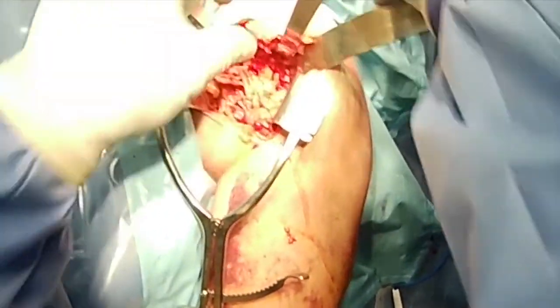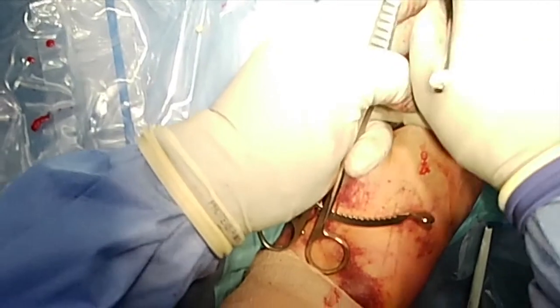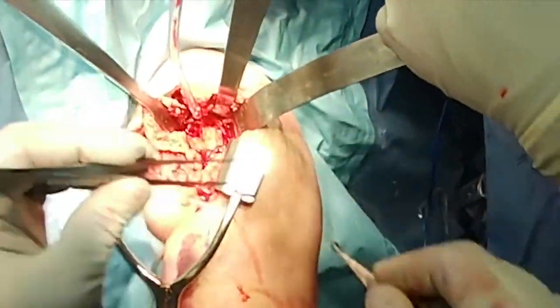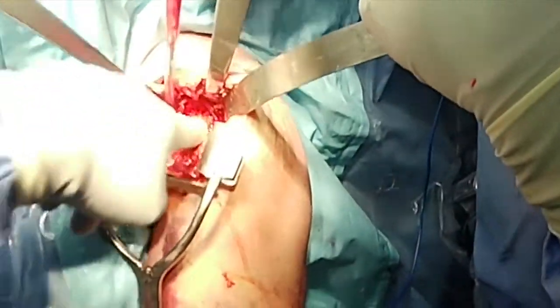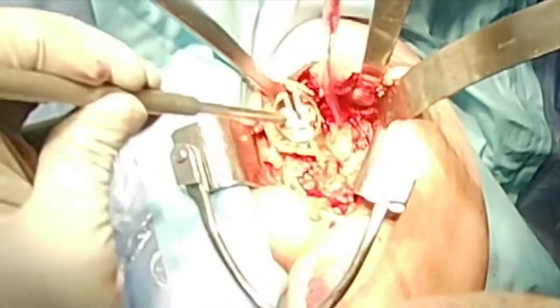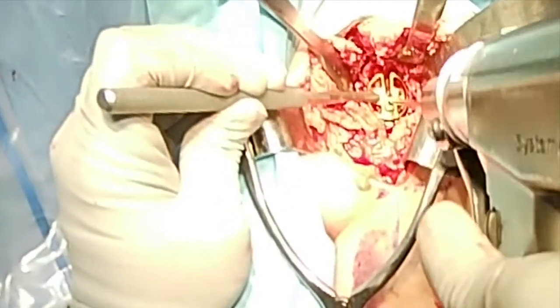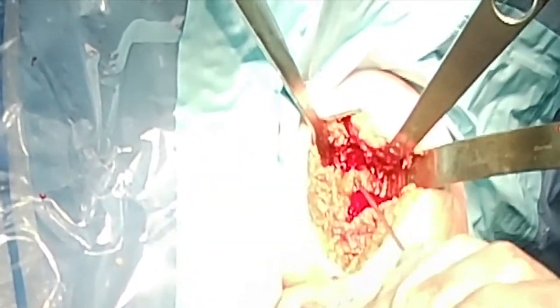Once that has been done, the glenoid surface is prepared. Although there is some wear of the glenoid surface, there are some loose fragments of cartilage which are scraped off using a fork and spoon before starting preparation for insertion of the glenosphere. The principles are still the same — one must try and place it in the bottom quadrants, making sure to remove all fibrotic and scar tissue. This is the insertion guide for the base plate, which has an inbuilt 10-degree inferior tilt. Then insert the guide wire, followed by reaming to the appropriate level. Be careful, as the bone is likely to be soft, and avoid any over-reaming.